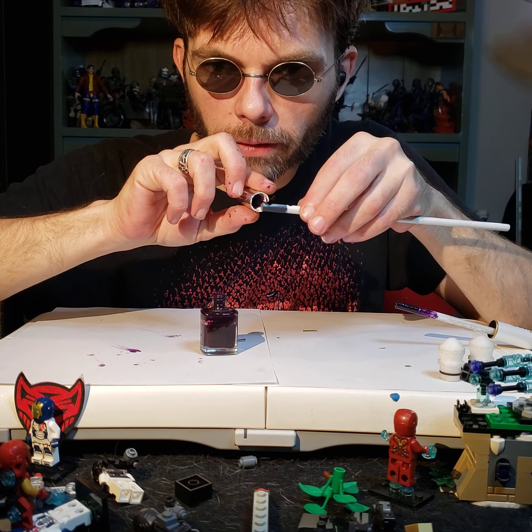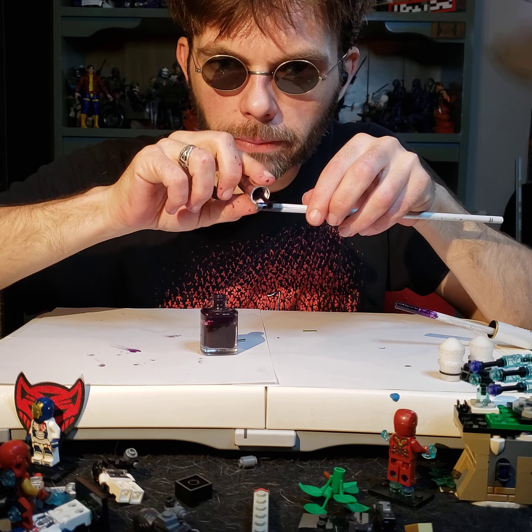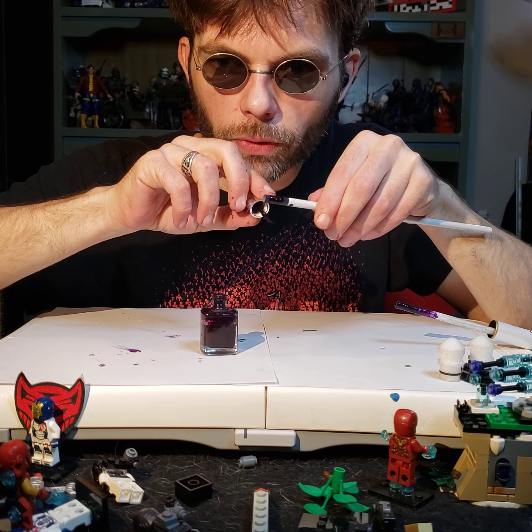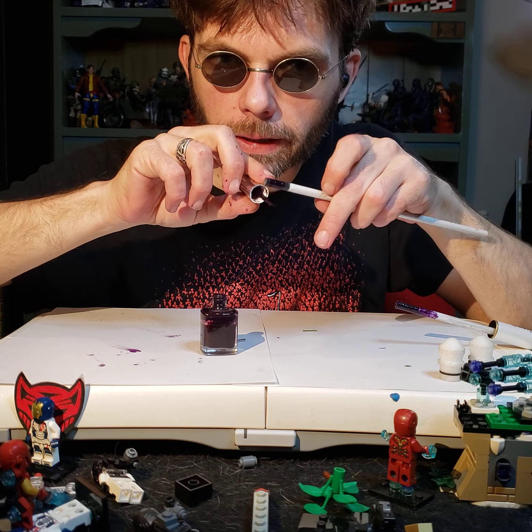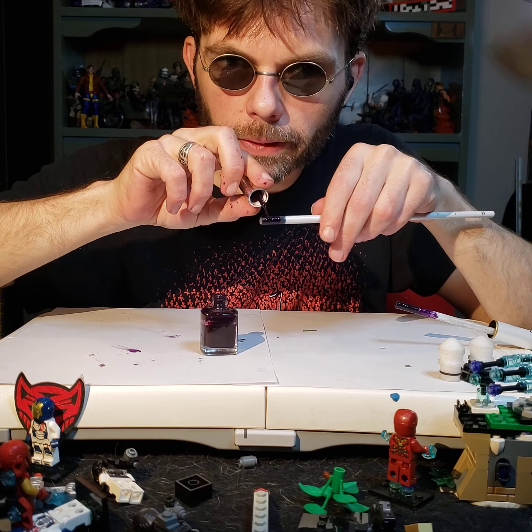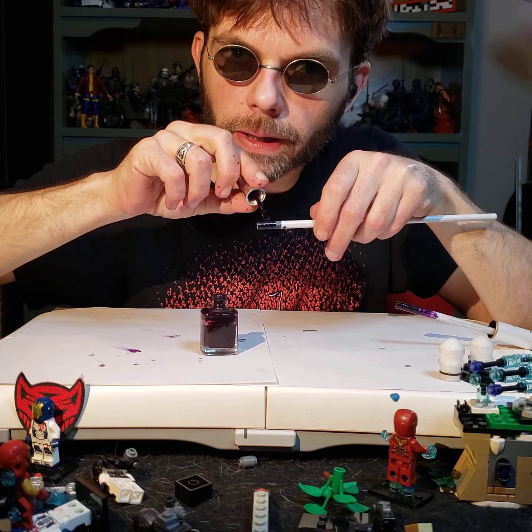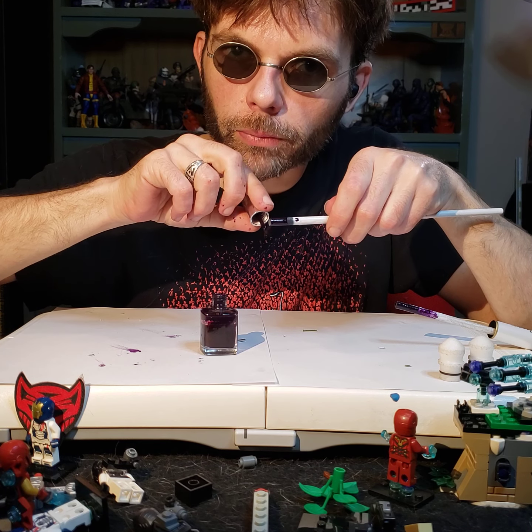That's why I put paper down, because I plan to not make a mess, but at the same time, I understand I may make a mess. So it's important to plan for disaster, especially when you're blind. Messes are always so much worse to clean up when you're blind. Now let's move this around and move that around.